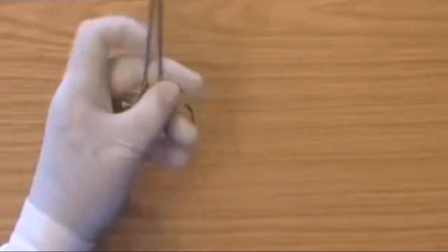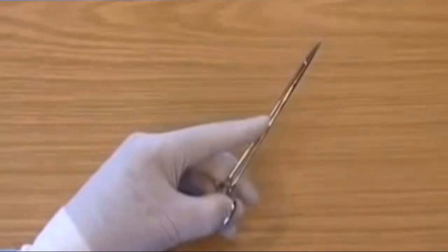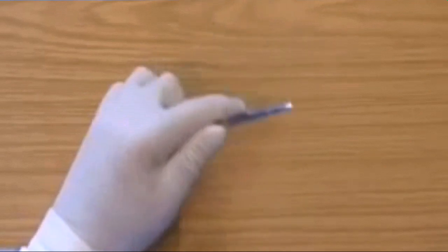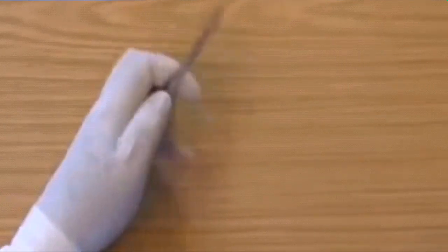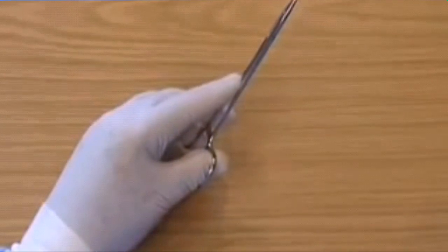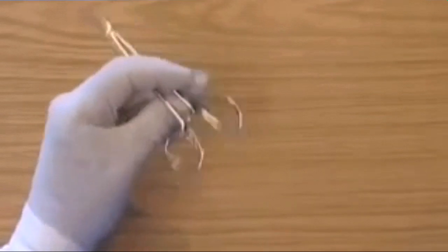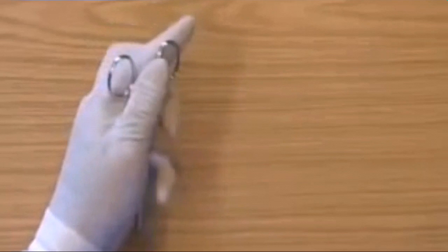Changing back to the standard grip. Changing to the palm grip. Changing to the standard grip. Changing to the palm grip. Changing to the reverse grip.